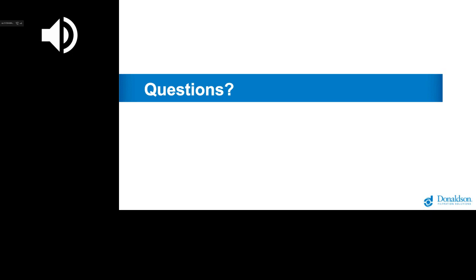Yeah, I think that's a question I can answer. So activated carbon filters, you have not seen that here in the presentation because from our standpoint, only the activated carbon absorbers are bringing the right level of reliability in the system, because we have to look at the fact that the amount of activated carbon in an activated carbon absorber is much higher than in the filtration system.